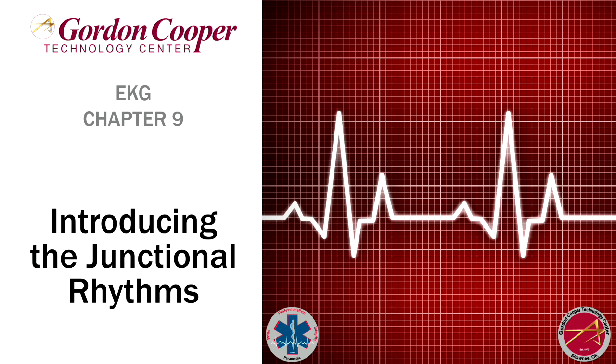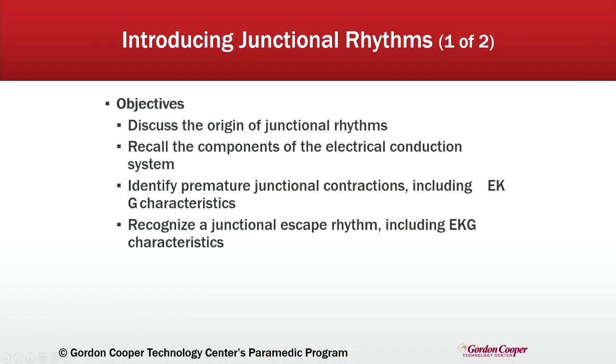EKG Chapter 9, Introducing the Junctional Rhythms. Congratulations if you made it through that last video. This one will be a little easier to get through. Let's see what we're going to talk about.